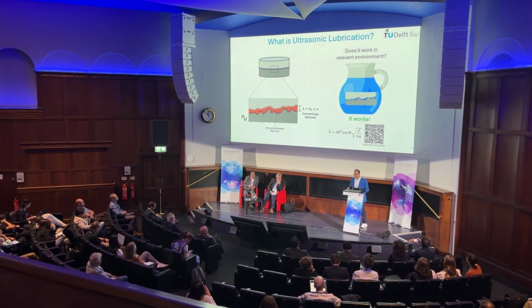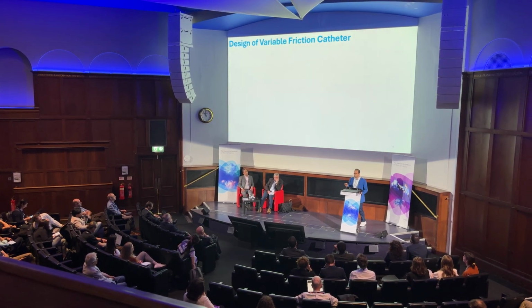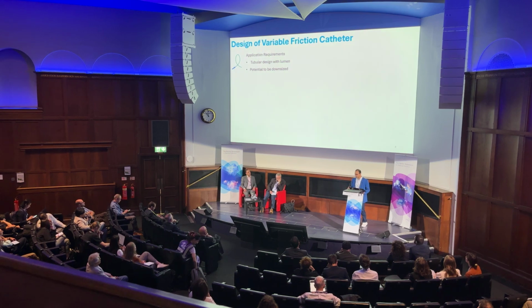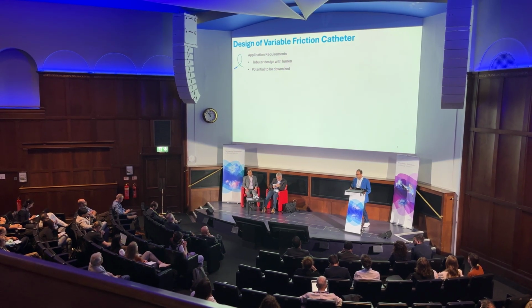So now that we know that this technology can work in the relevant environment, the question is, how can we translate this into an actual design? We looked into the design requirements for the application. We need a tubular design that has a lumen, and it has to have the potential to be downsized.